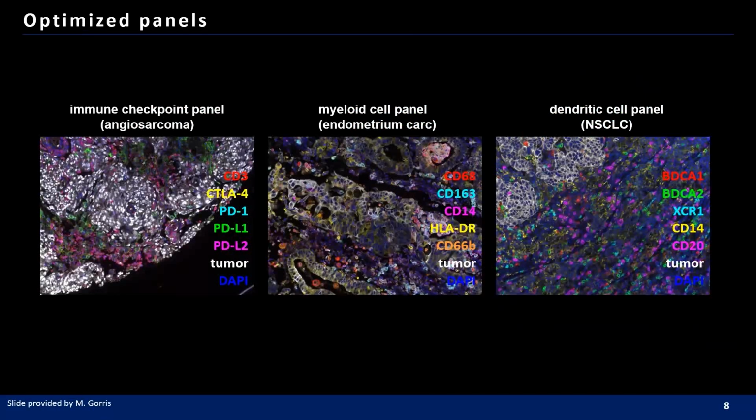Deciphering very complex samples is very intricate, not only when it comes to post-processing and analysis, but also when it comes to the technique itself, especially deciding on the antibody choices and the staining sequence. For this reason, there are many off-the-shelf panels that have been optimized for different tissue samples for identifying specific cell populations or distinct markers which are correlated with therapeutic success or failure.